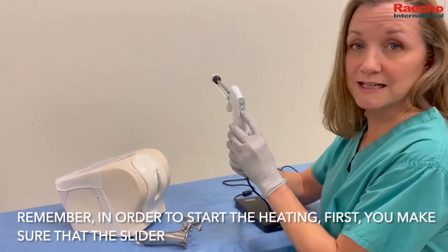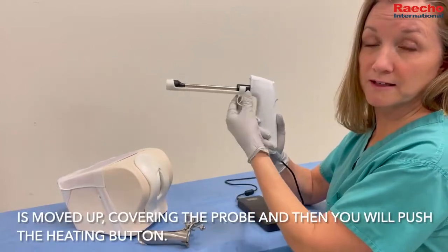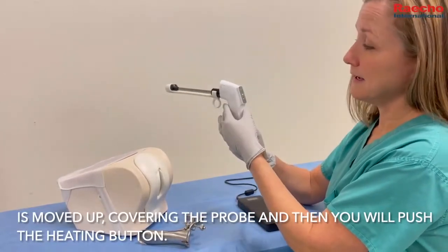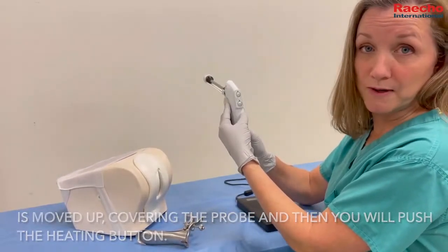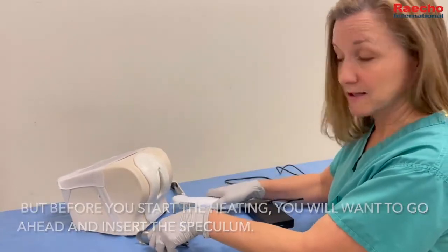In order to start the heating, first make sure that the slider is moved up covering the probe, and then you will push the heating button. But before you start the heating, you'll want to go ahead and insert the speculum.